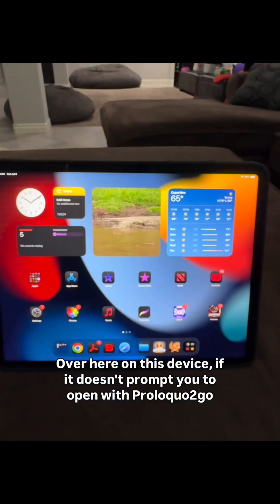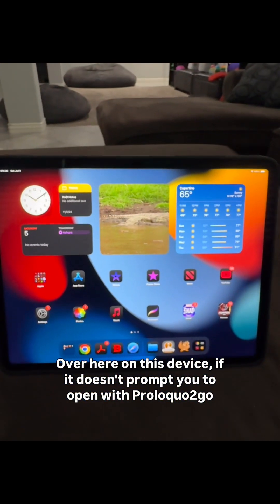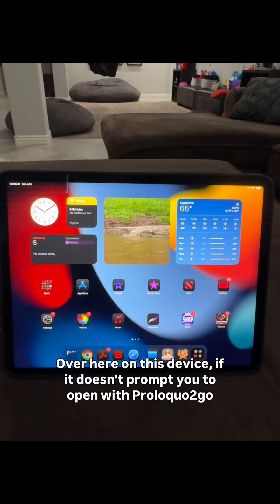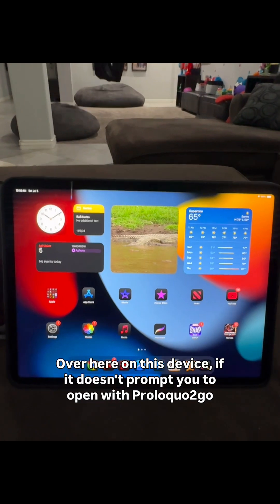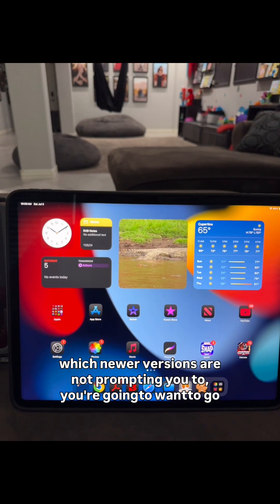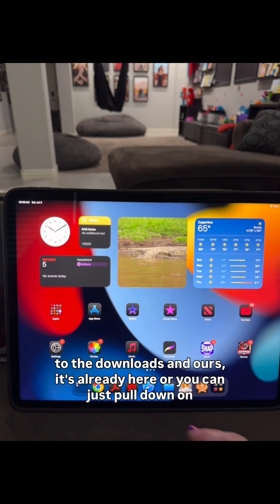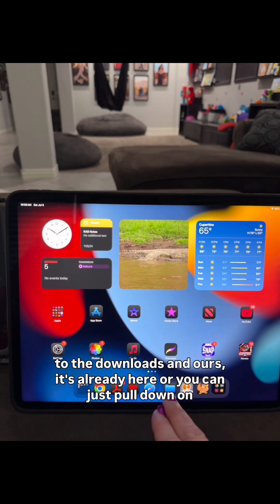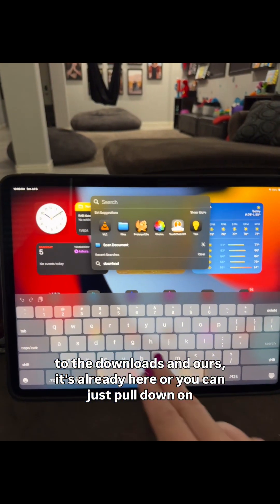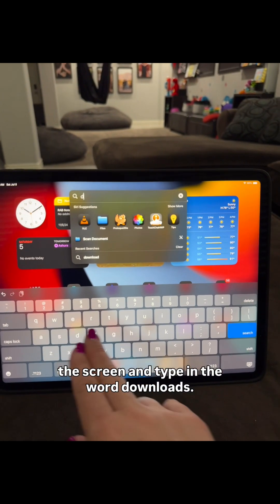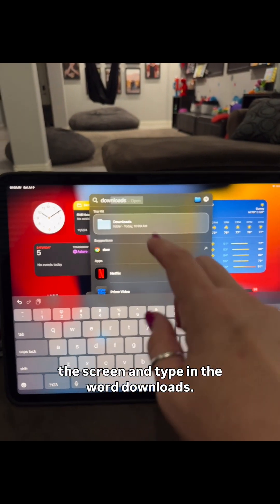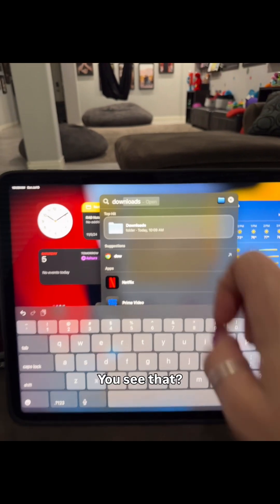Over here on this device, if it doesn't prompt you to open with Proloquo2Go — which newer versions are not prompting you to — you're going to want to go to the Downloads folder. In ours, it's already here.